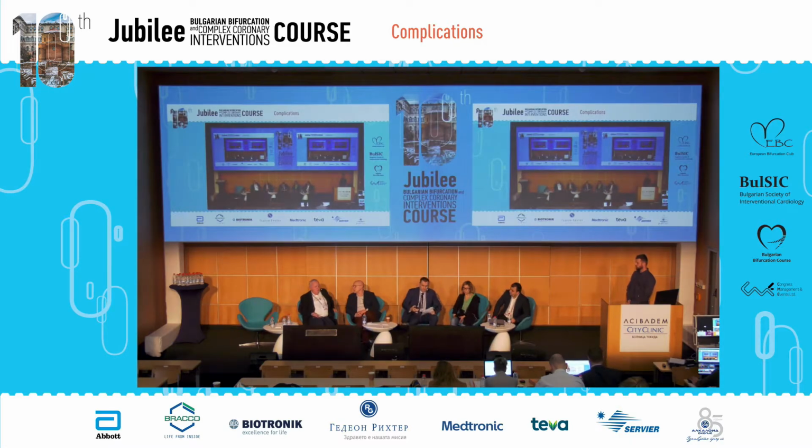We're using minimal protrusion into the main branch, and this is helping us to finish the procedure with final kissing balloon, which is very important in all double stent techniques, which was not the case in the previous studies, in which we know the crush technique, it was not possible to make the final kissing balloon inflation.